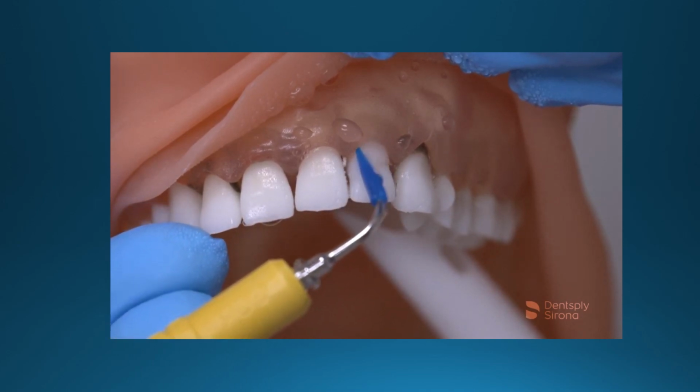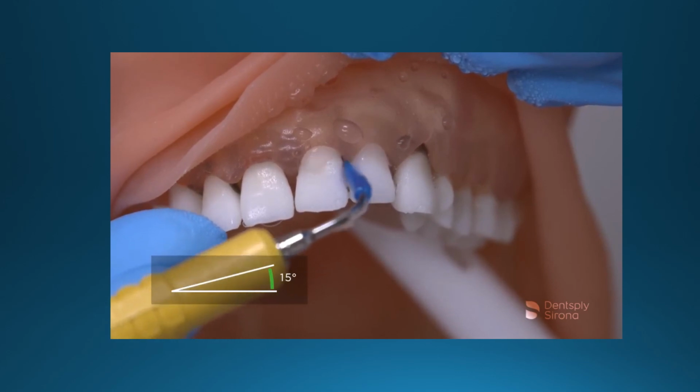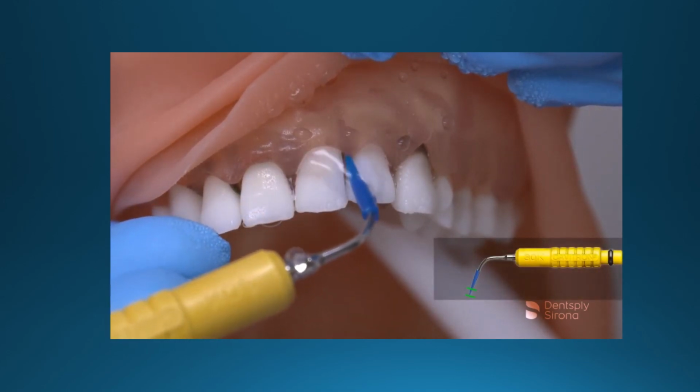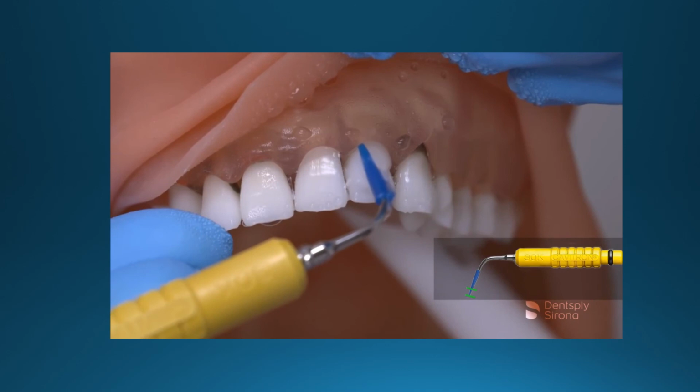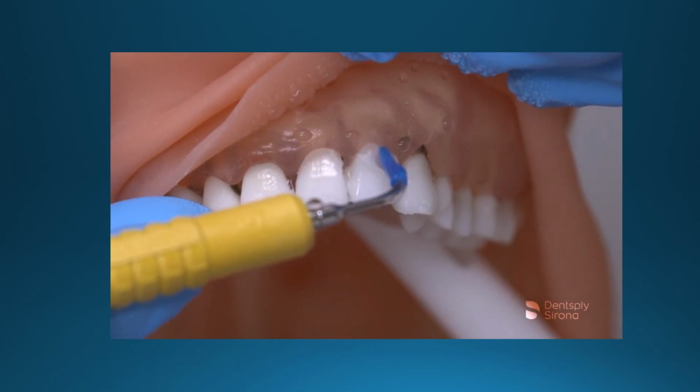The insert terminal end is placed slightly subgingivally with a 0 to 15 degree angulation and 2 to 3 millimeter adaptation. Utilizing a 1 to 2 millimeter overlapping stroke will ensure thorough biofilm debridement.